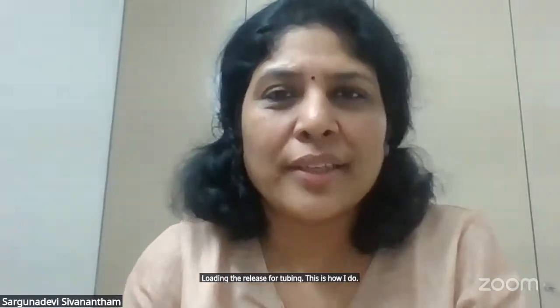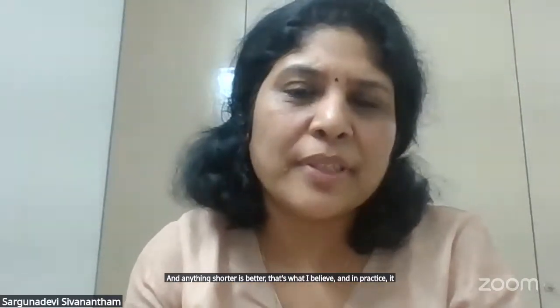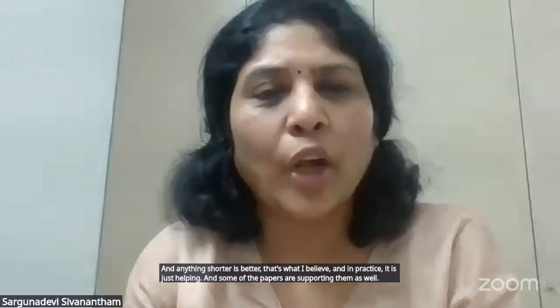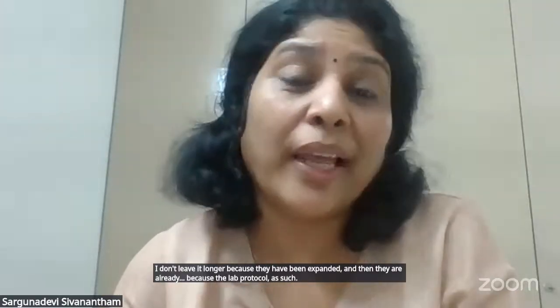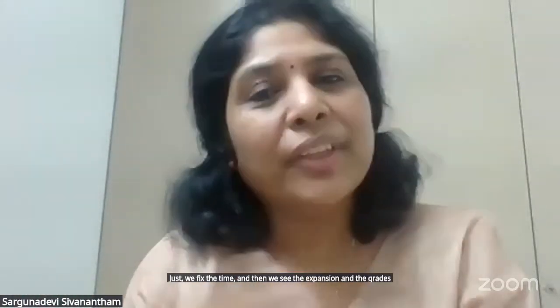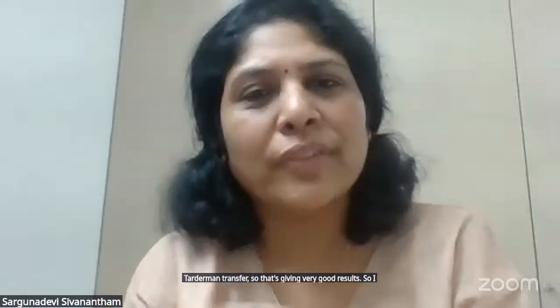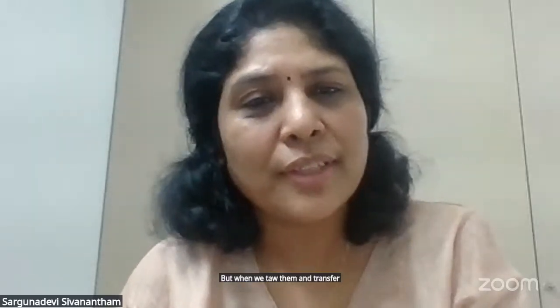Anything shorter is better. That's what I believe, and in practice it is helping, and some of the papers support it as well. I don't leave it longer because of the expansion; the lab protocol, even for non-biopsy normal patients, is that we fix the time, see the expansion and the grades, and freeze, thaw and transfer. That's giving very good results, so I follow the same with these embryos. I don't give them much longer. But when we thaw them and transfer, obviously it's 2 to 3 hours before they re-expand.